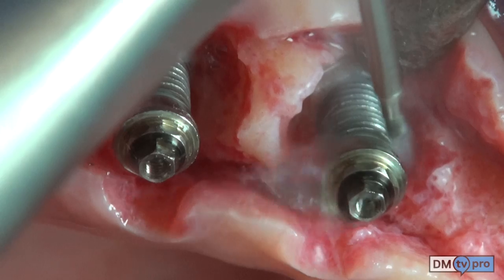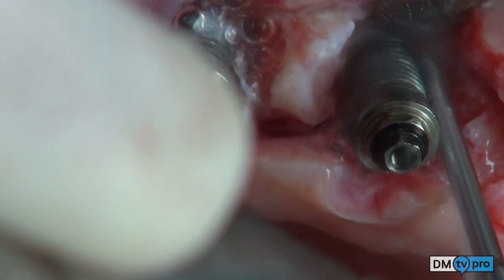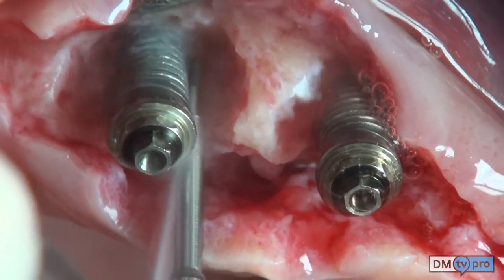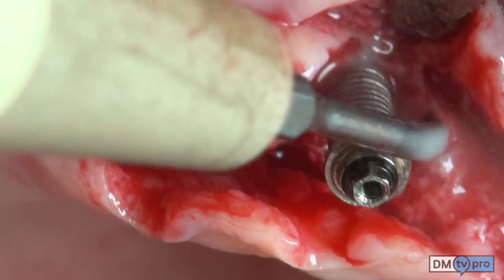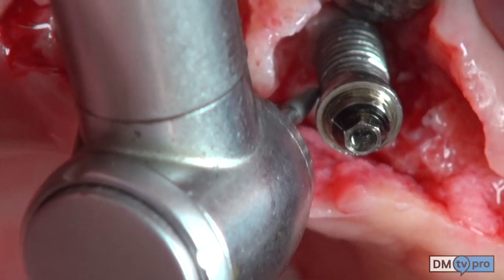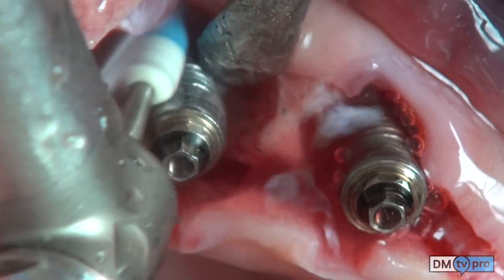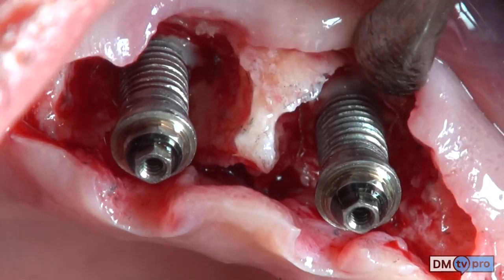Ultrasonic instrumentation completes the debridement. In the portion of implants outside the intrabony defect, the surface is polished by means of a diamond burr on a red-ring handpiece and with rubber tips.